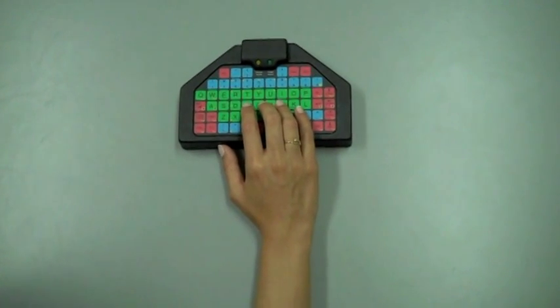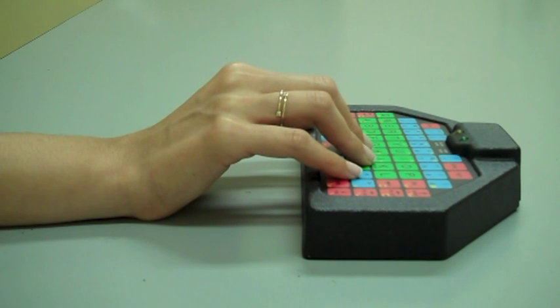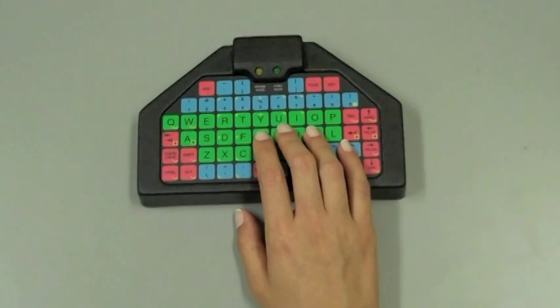You will notice the forearm is pronated just like in the standard keyboard. You can see the base of the mini keyboard is higher compared to the standard keyboard. Therefore, there is more wrist extension. Wrist extension can be eliminated by using a hand rest so the keyboard is at the same level as the wrist. The participant will be typing the word candy.